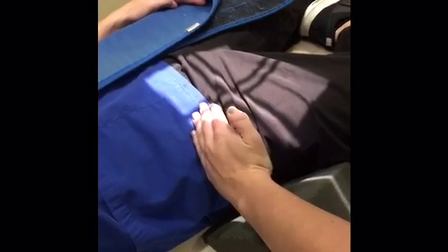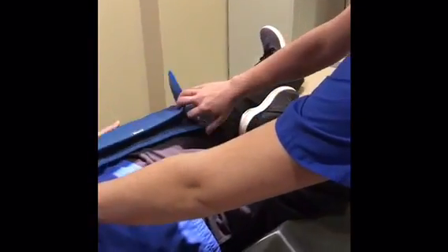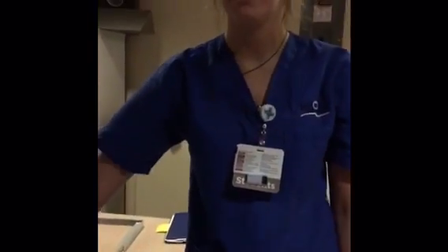That looks good. Still making sure that I am including her ASIS in the projection and making sure that I do have light outside of the collimation. This will be the same deal with shielding my patient. I still will not be able to shield her right side because it is in the area of interest. So I want to make sure that I am shielding the left side.